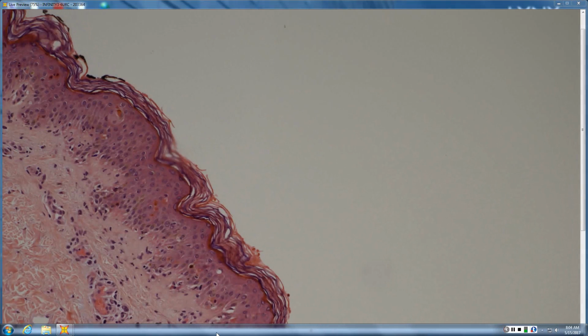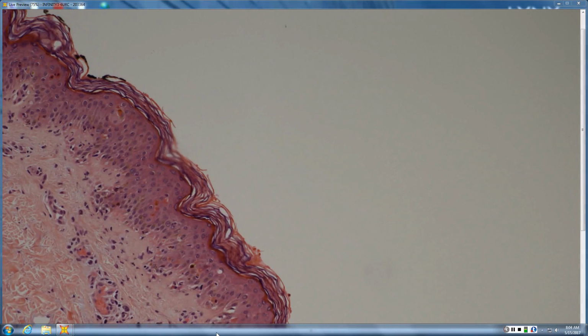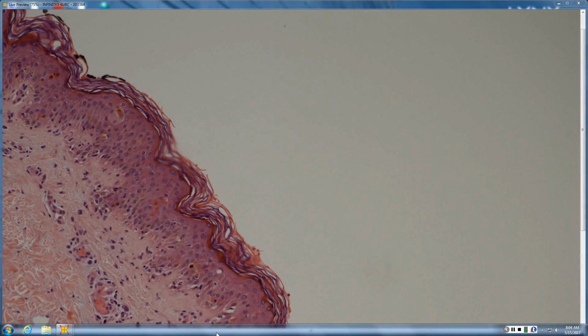GVH absolutely can do it, but tends to be a little more subacute. You usually have a few more lymphs, exaggeration at the acrosyringium, and some background epithelial disorder. It's like EM. Like erythema multiforme or toxic epidermal necrolysis. Very good.